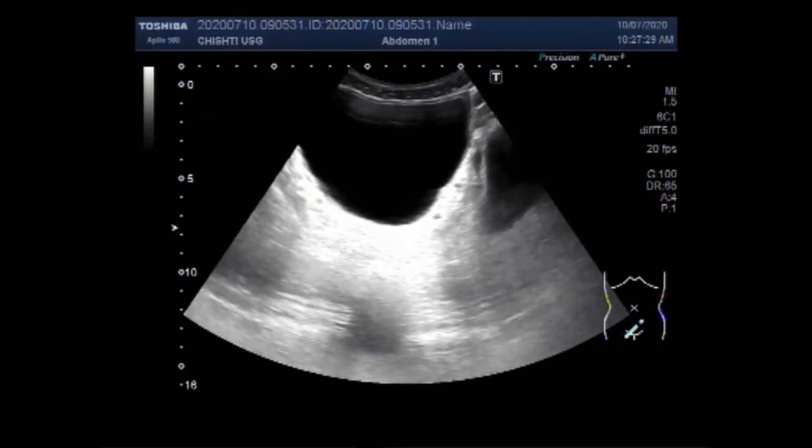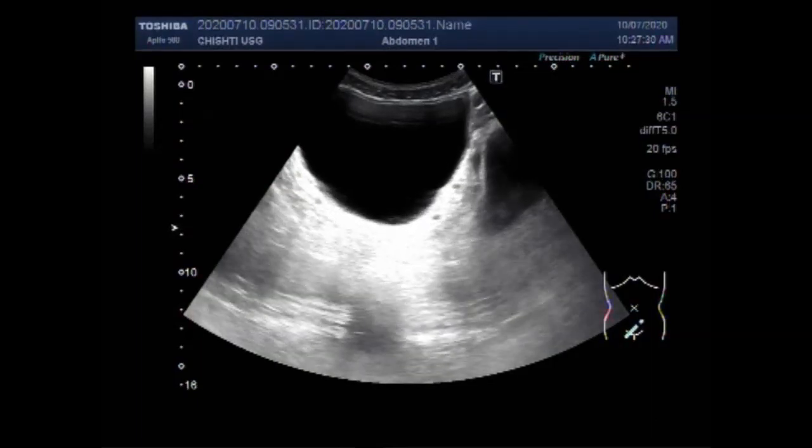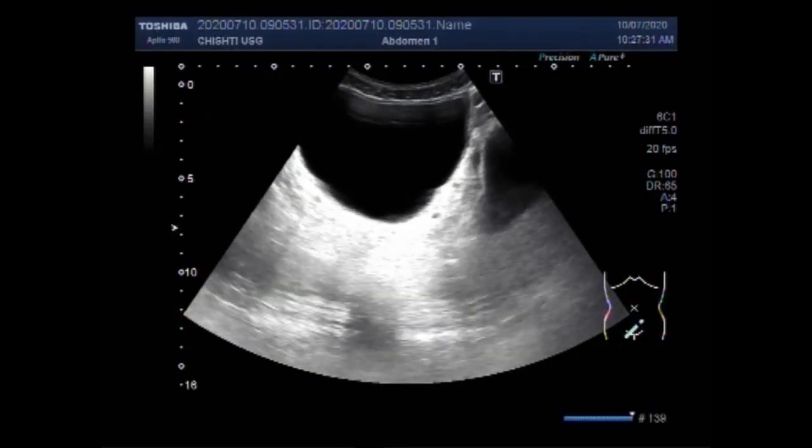Dear Viewers, I hope you are all fine. This ultrasound video shows enlarged seminal vesicles.